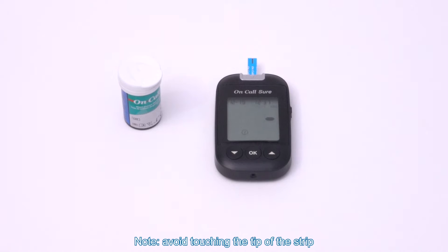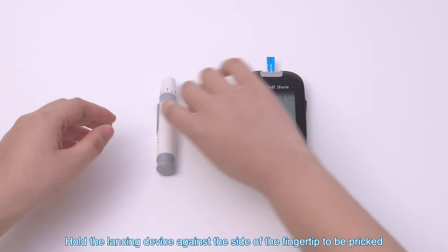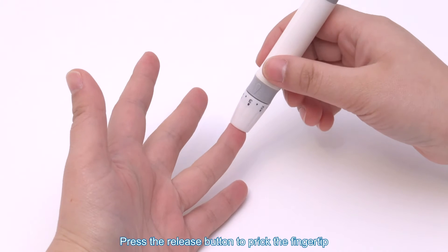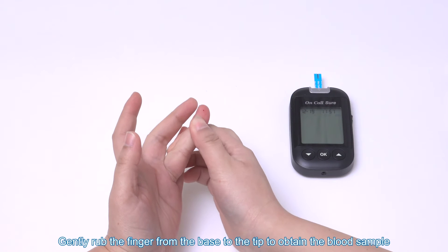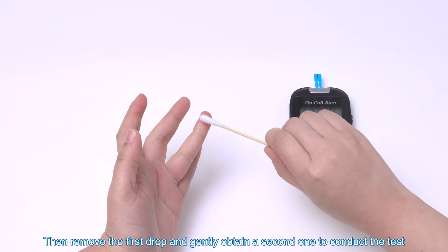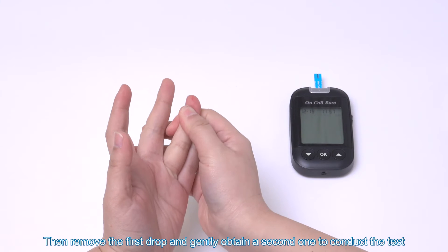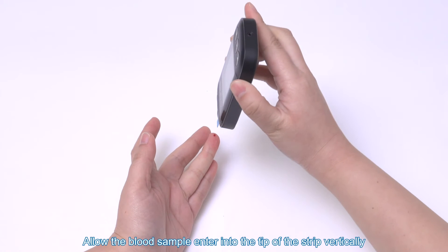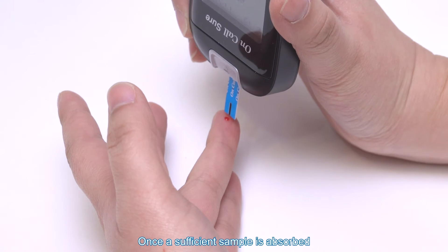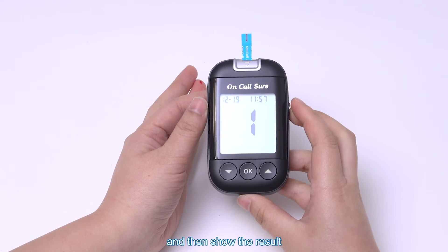Note: avoid touching the tip of the strip. The meter is ready for test only when the blinking symbol appears. Hold the lancing device against the side of the fingertip to be pricked and press the release button to prick the fingertip. Gently rub the finger from the base to the tip to obtain the blood sample. Remove the first drop and gently obtain a second one. Allow the blood sample to enter into the tip of the strip vertically. Once a sufficient sample is absorbed, the meter will count down from 5 to 1 and then show the result.